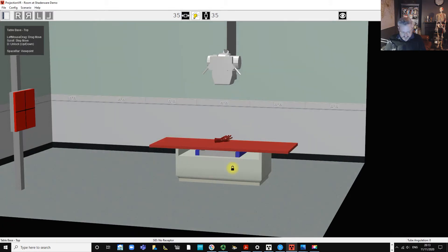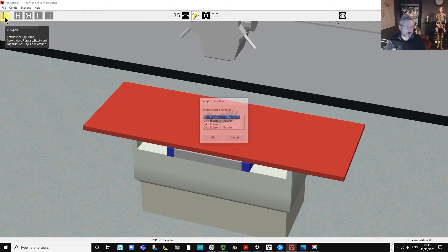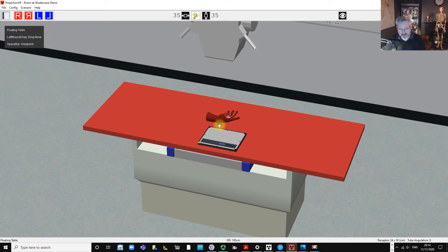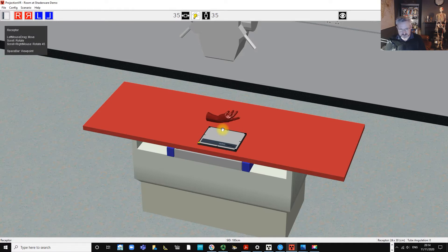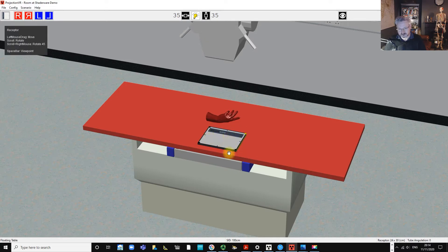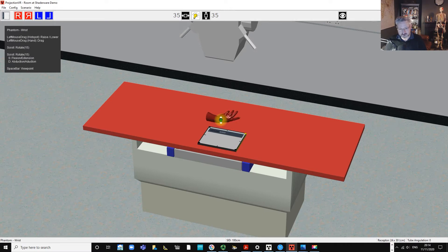We'll bring our patient into the room and raise the table. In the old days this used to be done by splitting a receptor into four — putting a bit of lead to cover three quarters of it and x-raying each projection in its own space. That gave a pleasant appearance, but we can't do that these days because each image has its own metadata. Having four projections with only one set of metadata is messy, so we do four separate projections of the hand and wrist.